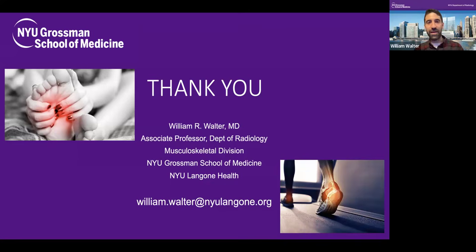But open and these semi-open weight-bearing MRIs are notoriously bad image quality. So yes, I would say that there's a strong affinity for conventional MRI over open. Especially when it's the foot and ankle, even your nervous patients will do pretty well with that exam in a conventional MR, because it's not a brain MRI where their head has to be right inside the coil, for example. So that's what I would say about that.